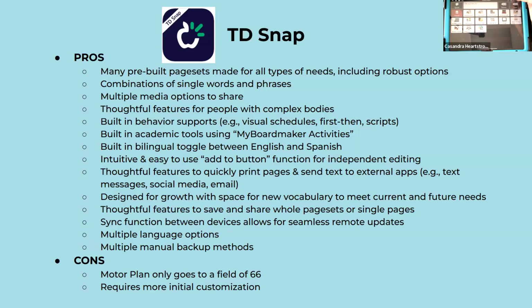You can share whole page sets or single pages within this. You can use the sync function: I could edit a student's device on mine and then push sync and it will automatically sync with their device. There's tons of language options and there's multiple backup methods.